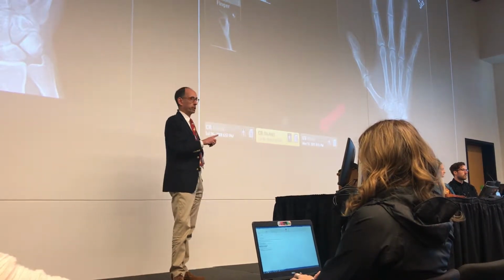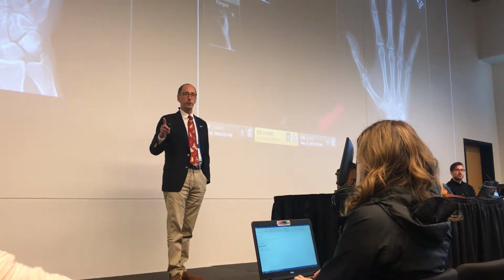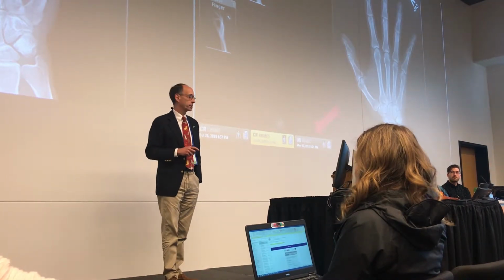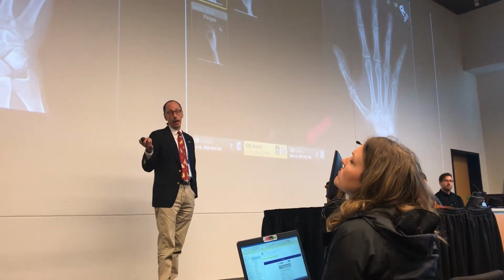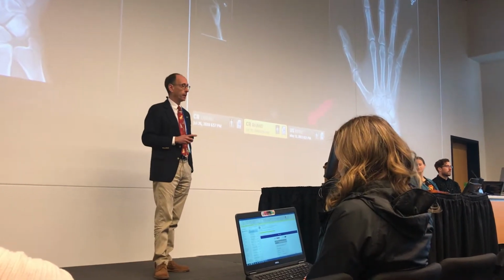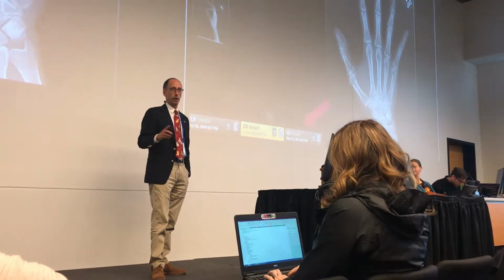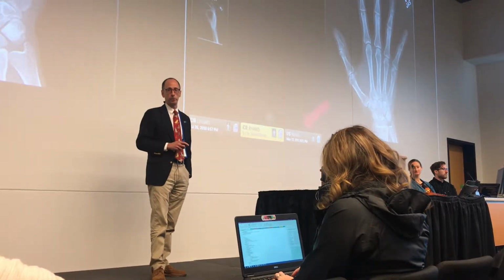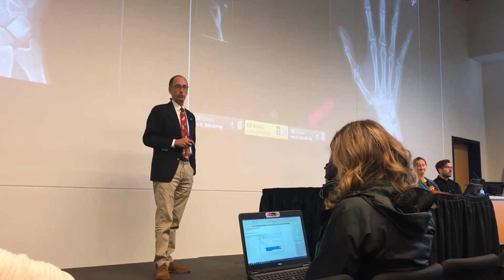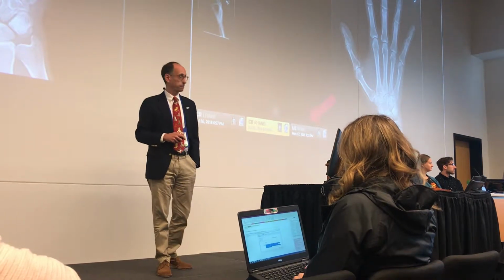And as CT mentioned, if patients had a CT and MR on the same day, an X-ray and a CT, X-ray results are released immediately, CTs and MRs and PETs at 7 days. In addition, if I've ever had an X-ray study, because we loaded all studies back in perpetuity, I could go to one of my old ones, get into the viewer, and potentially see the report today for a CT I had, and I'm not supposed to see it for a week. So we disabled that. And if you try to click on it, you get this message saying report viewing is not authorized.